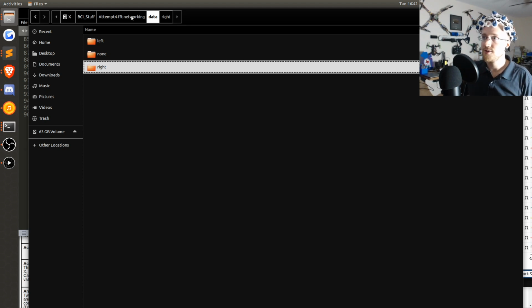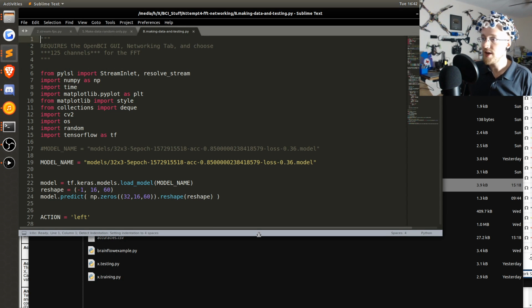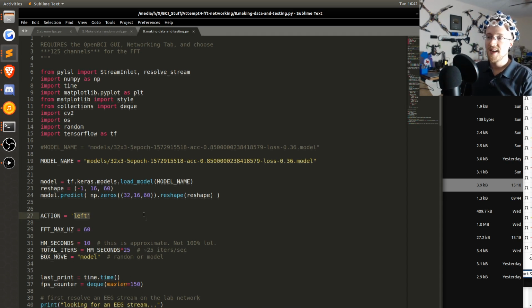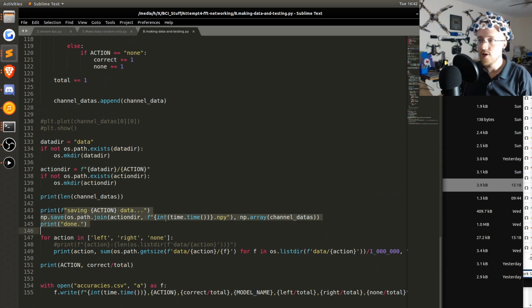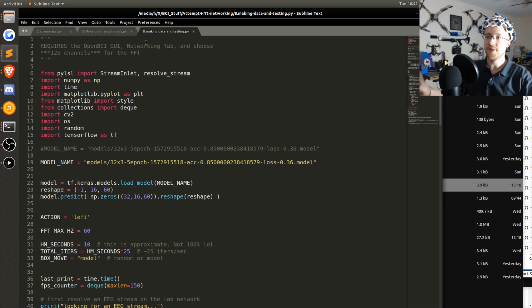so I can much more quickly iterate through things, test them, and run it live. Because what I ended up doing, after I train a model, is run this script here, which loads that model, and then I say, I'm going to think left. It's going to use that model to read that FFT data, make its prediction, and hopefully go left. And at the end, it saves the data as a left, right, or whatever. So this is the script that I usually end up running the most, which is simply constantly running models. It's almost like two things are happening at the same time: we're creating data, and I'm testing the model at the exact same time.